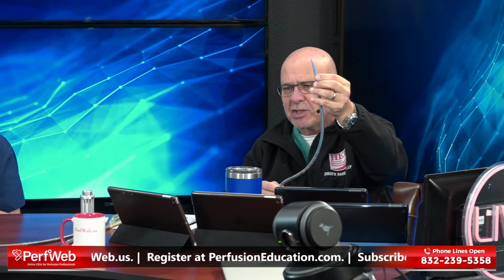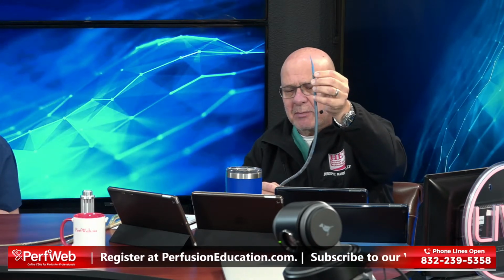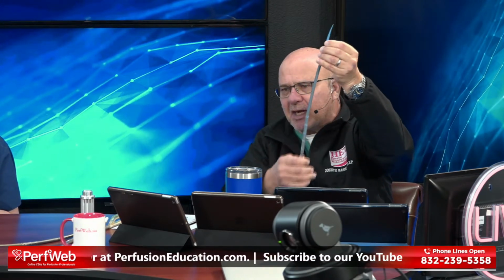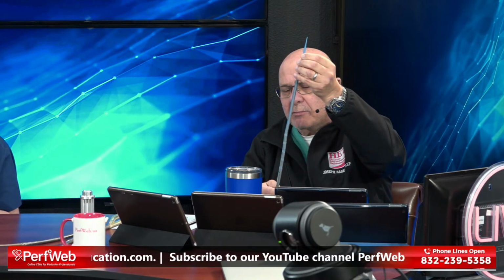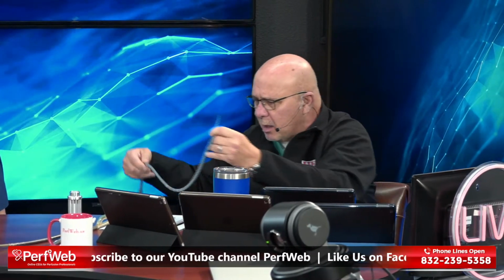This is the guide here, so that would come out. The tip is usually at the IVC-RA junction, or actually in the right atrium itself. And then you have drainage going all the way down, including being infrahepatic for your drainage there.